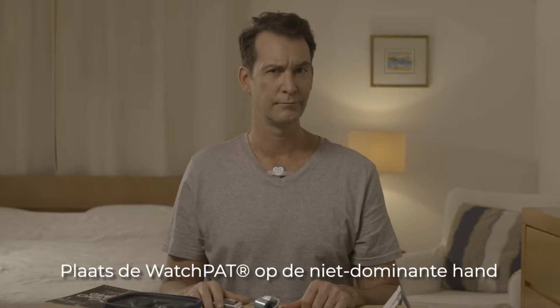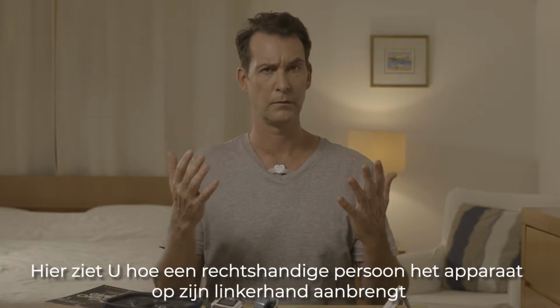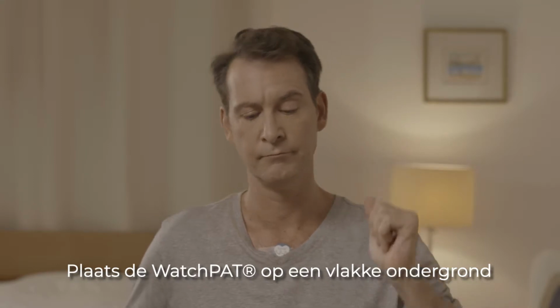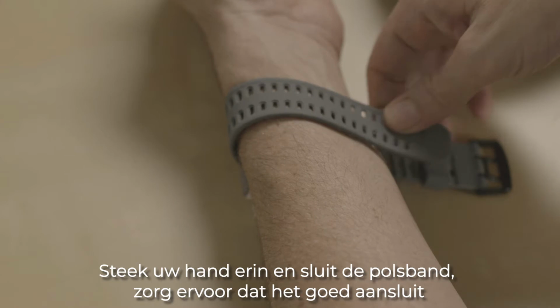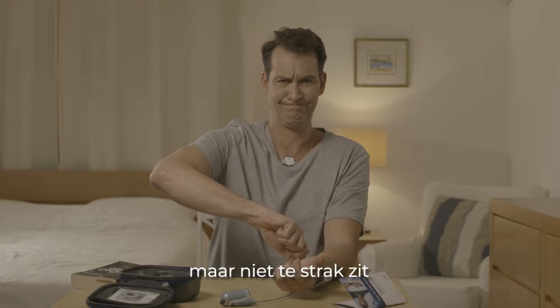You'll be putting the WatchPAT on your non-dominant hand. Here you see how a right-handed person puts the device on his left hand. Place the WatchPAT on a flat surface. Insert your hand and close the wrist strap, making sure it's snug, but not too tight.